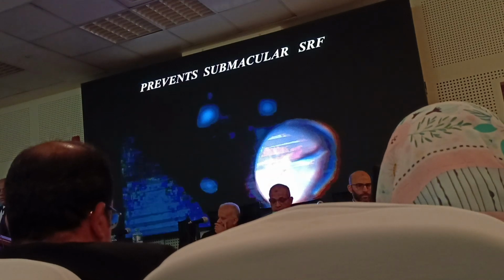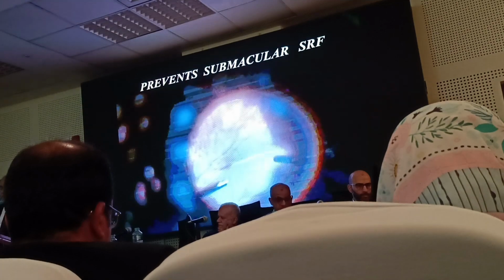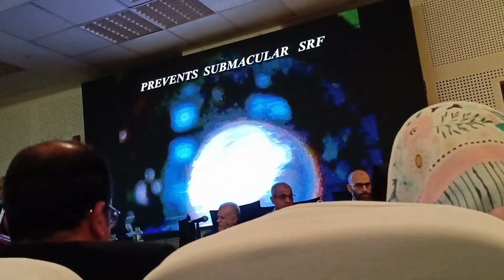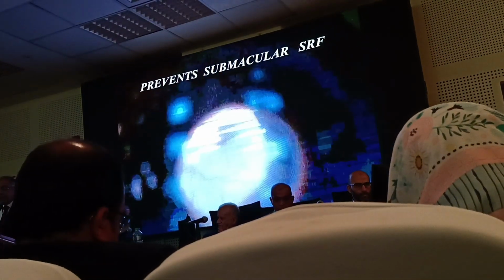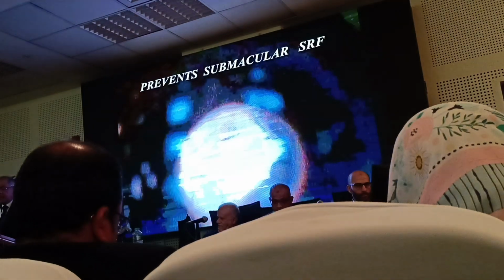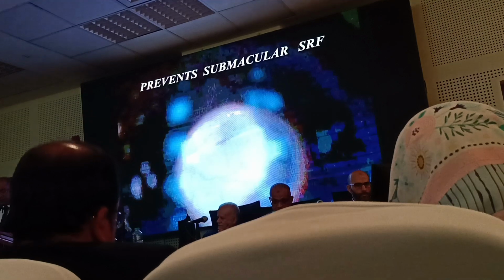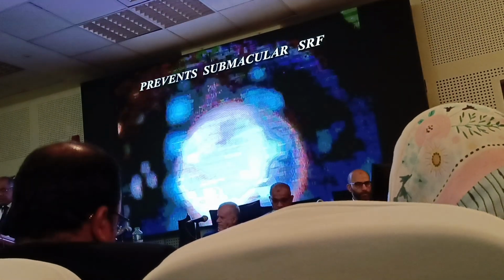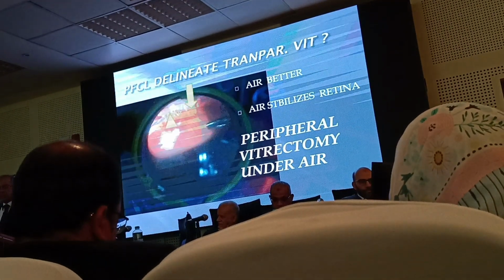Being heavier than water, it allows a more or less complete drainage without having a posterior drainage retinotomy and without displacing the fluid to accumulate on the macula, producing the macular fold. So this is actually the most valuable contribution of this liquid to retinal detachment surgery.